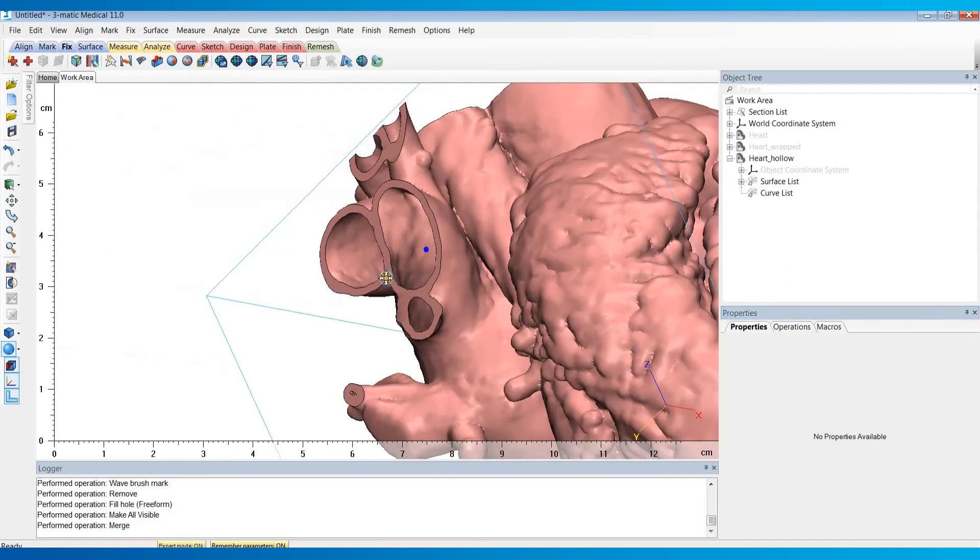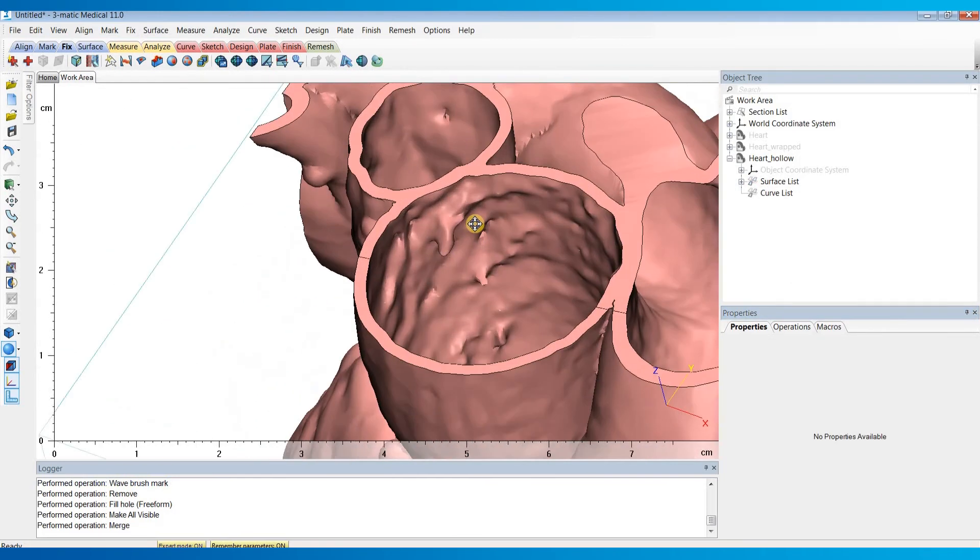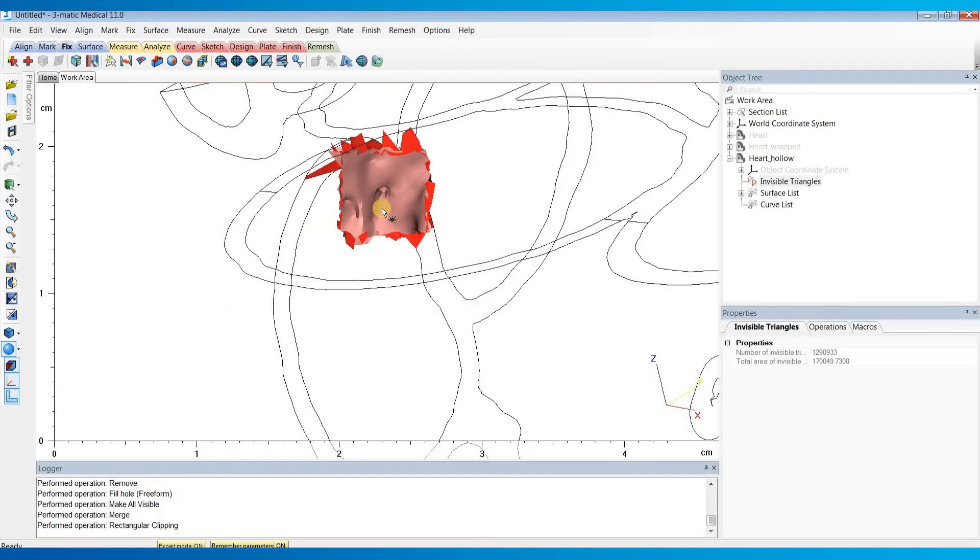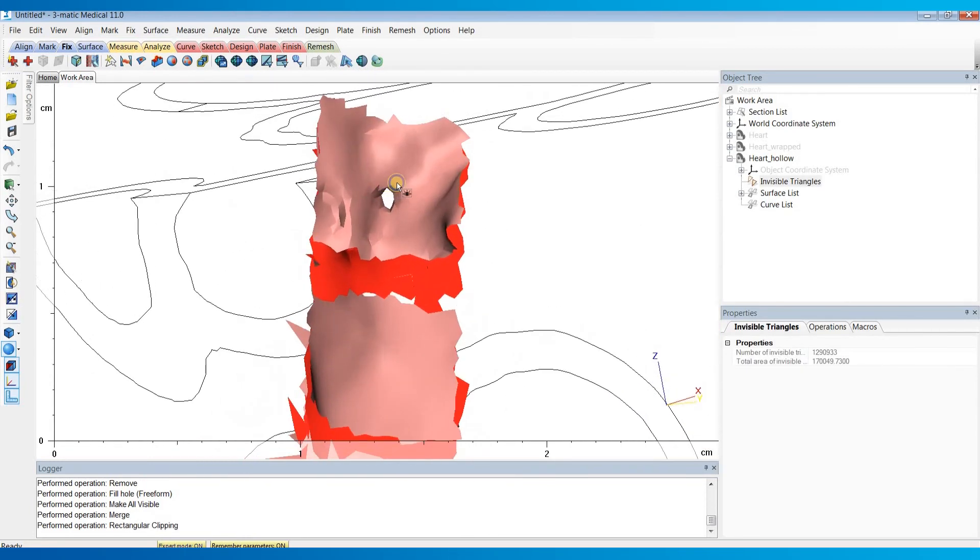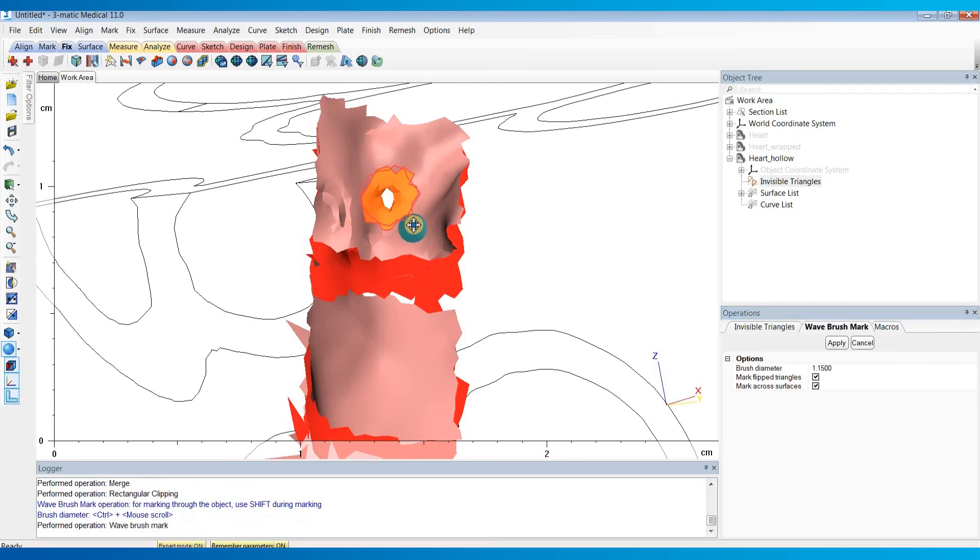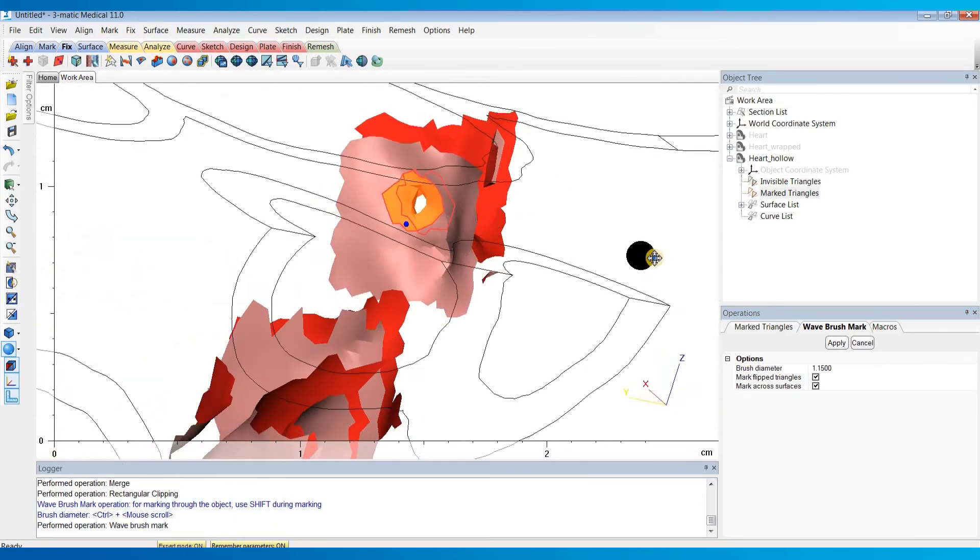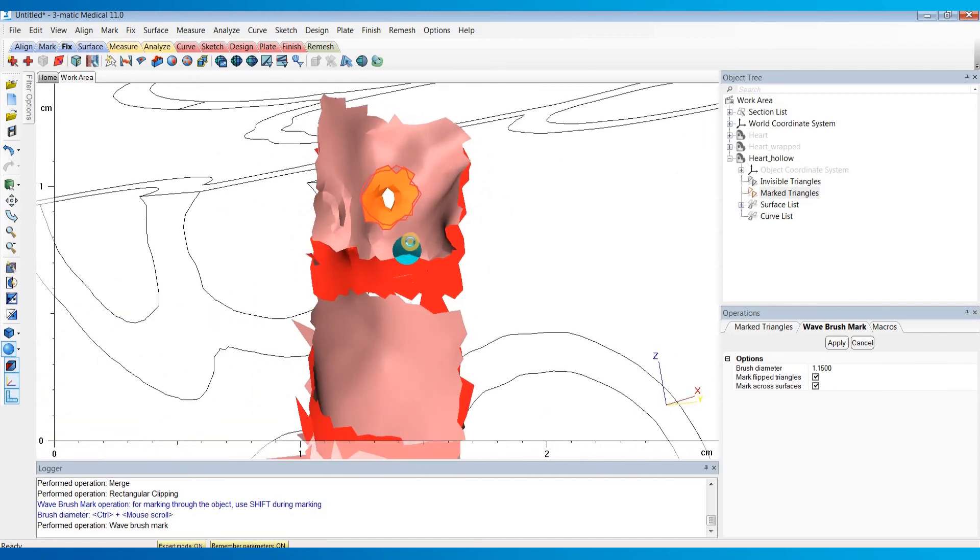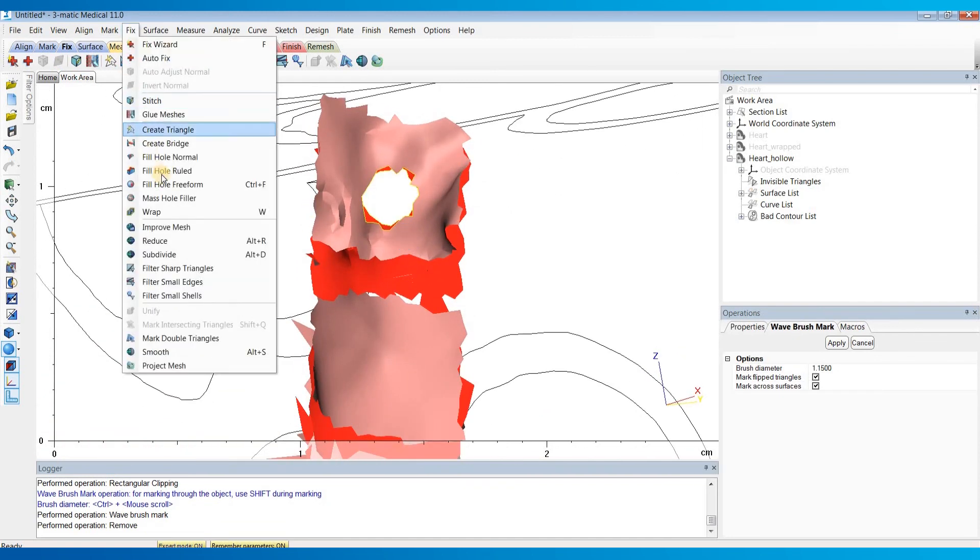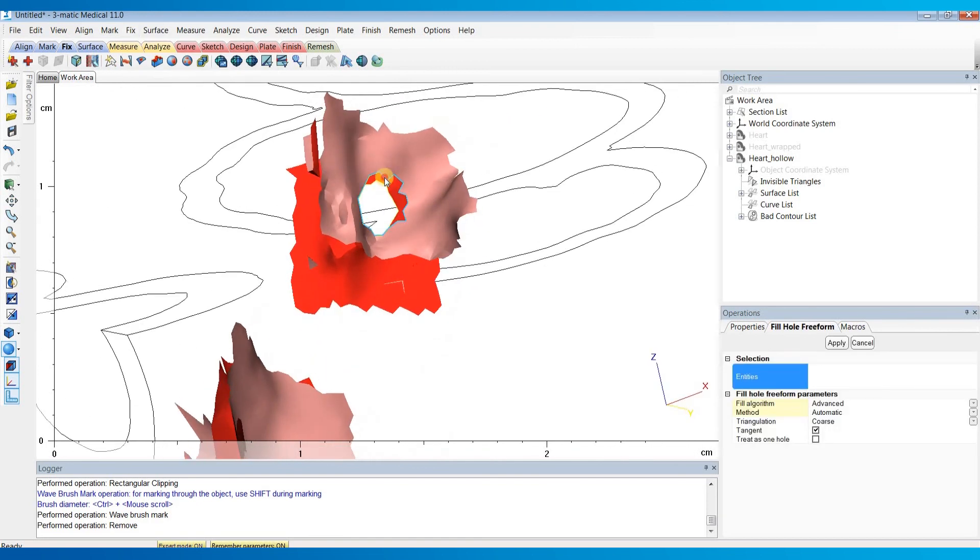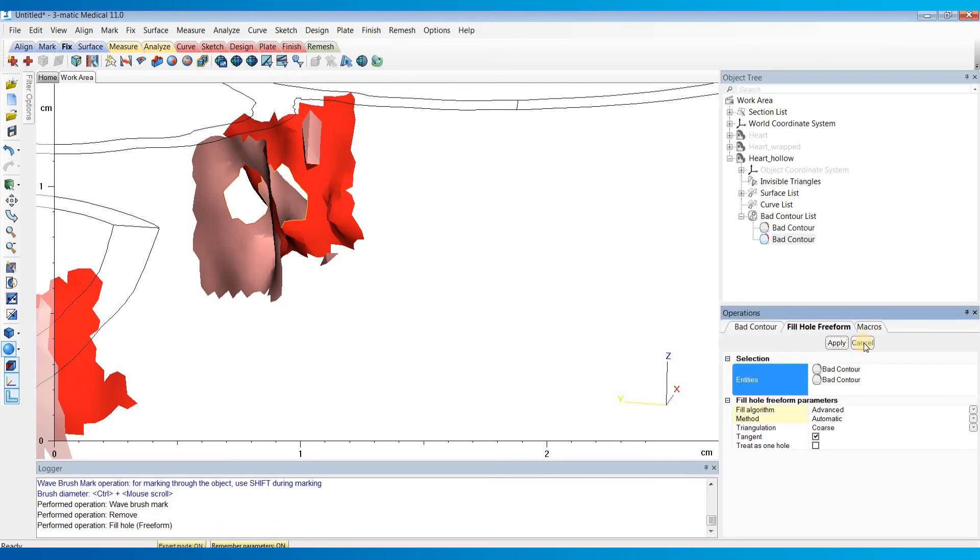Let's just run through that one more time on one of these other holes. Again, I like to use the rectangular clipping to isolate that region. I'll hit M on my keyboard to bring up the wave brush mark, hold down shift and left click to mark this region. Make sure it looks good, hit delete on my keyboard, and then I'll go to fill hole free form, select both of those bad contours, and hit apply.